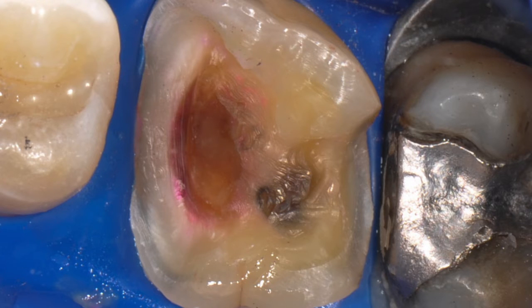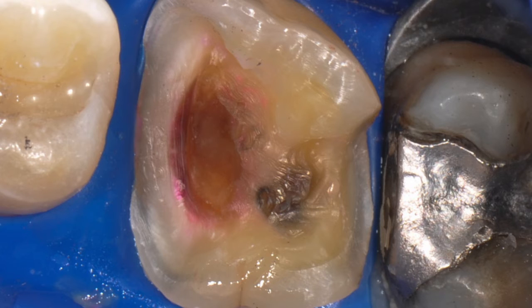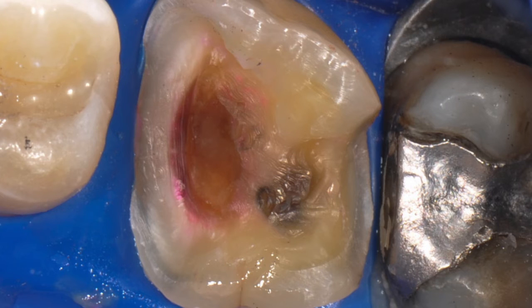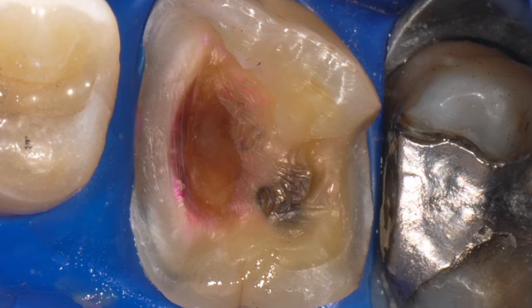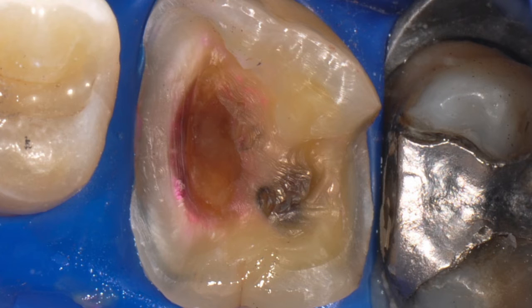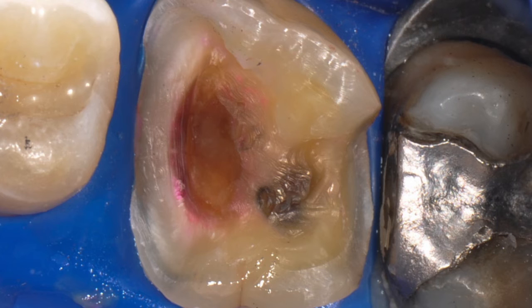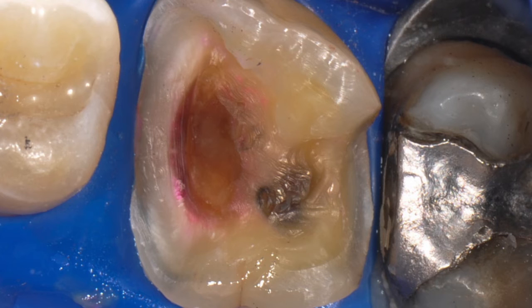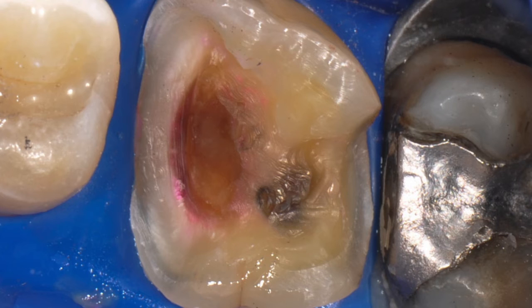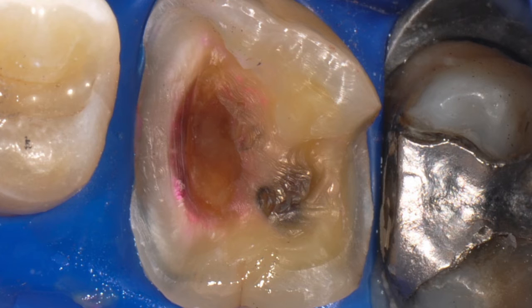The peripheral decay and all existing restorative materials are removed. The deep decay adjacent to the pulp must not be removed in order to avoid pulpal exposure. Caries detection dye is used to aid in the complete removal of caries in the peripheral areas needed to develop a seal around the deep caries. In this slide you can see the deep caries dyed light pink, but the dentin around the deep decay is not stained, indicating healthy bondable dentin.